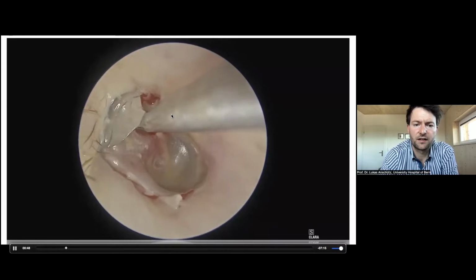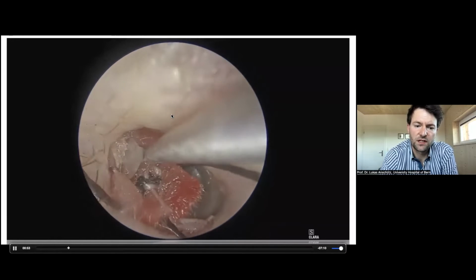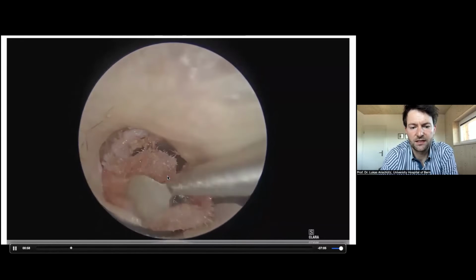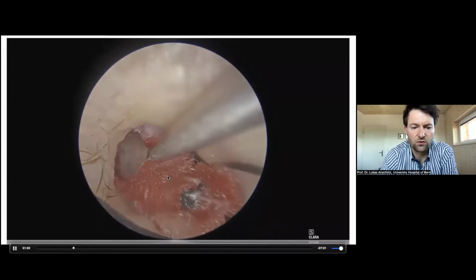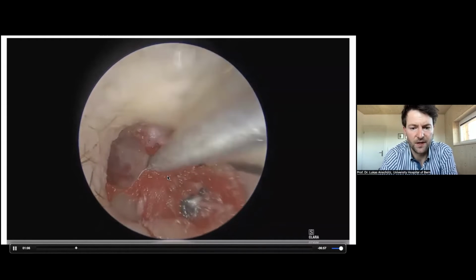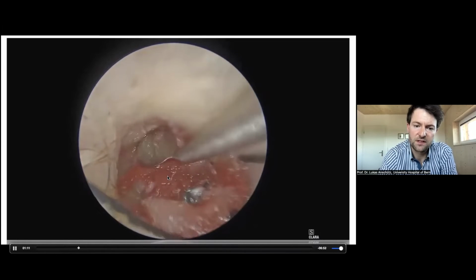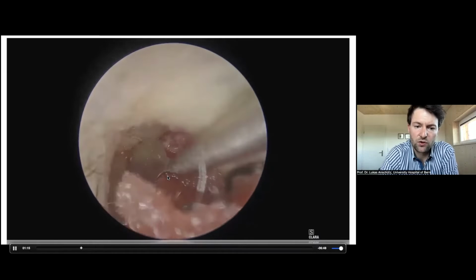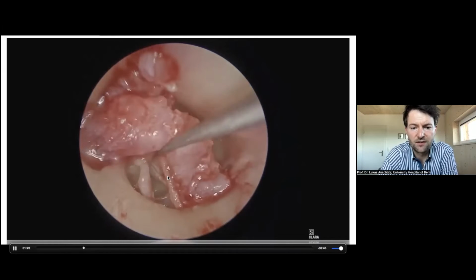And then with very regular cold instruments, you do the incision of the skin. And here also for the control of the bleeding, this is a neuropatty, a very small neuropatty, and it is soaked with adrenaline, 1 to 1000. So it's pure adrenaline, and we use it on one hand to dissect. You will see other examples a little bit later. And we also use it for hemostasis and you can see how it nicely develops.